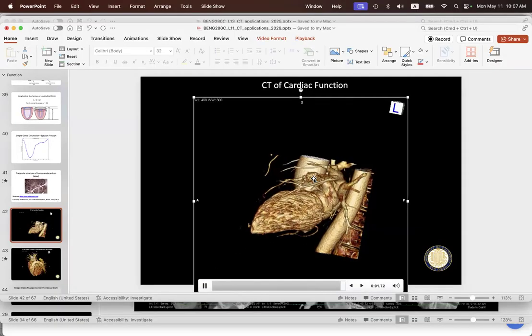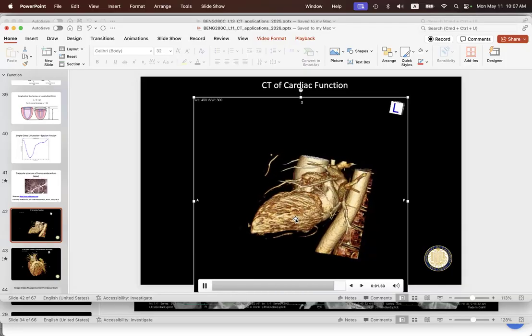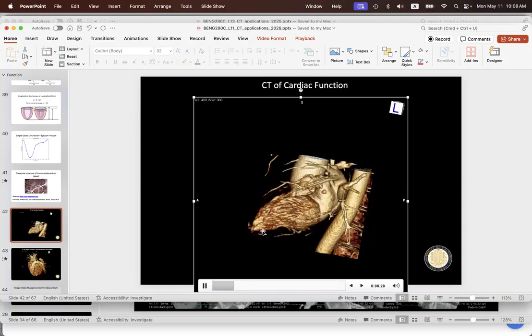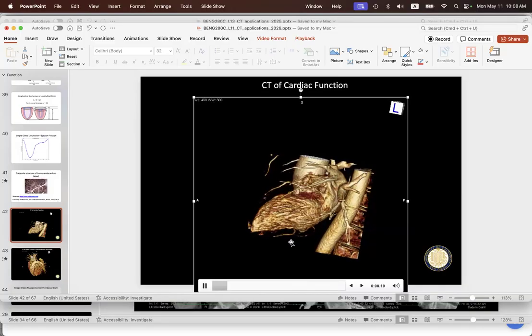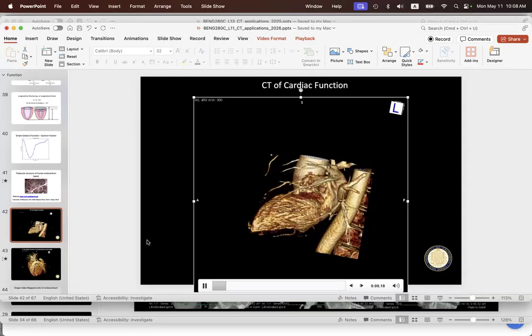Okay. So we can see the left atrial appendage contracting here and the left atrium, and it kicks ahead of when the left ventricle contracts. Watch, the first thing that happens is it gets a little bigger. See, it goes whoop. It's like it breathes in before it squeezes out. However, in observing this early on, this was 15 years ago, we were looking at this going, we should use this signal on the surface of this heart to quantify how much myocardial strain is occurring here. Because if we know these things should track, it's a coherent signal that tracks down, we can track it while it's contracting.